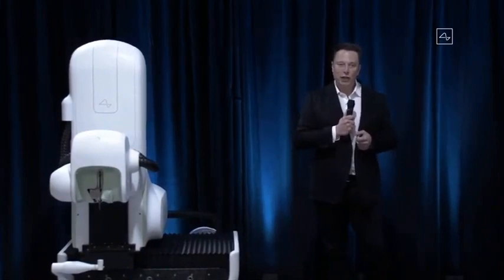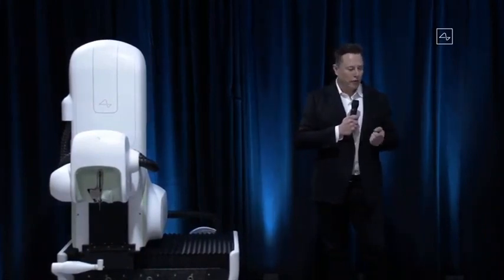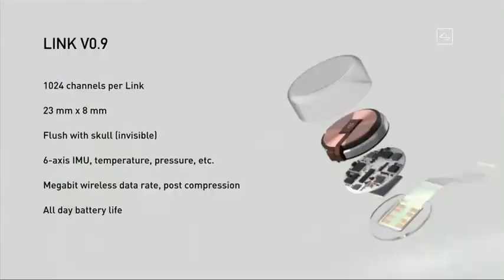It's also got all the sensors you'd expect to see in a smartwatch or a phone, like inertial measurement, temperature, pressure. So there's a lot of functions this device could do related to monitoring your health and warning you about a possible heart attack or stroke or other damage, as well as convenience features like playing music. You can do a lot. It's sort of like if your phone went at your brain or something. Maybe that's not a great analogy.